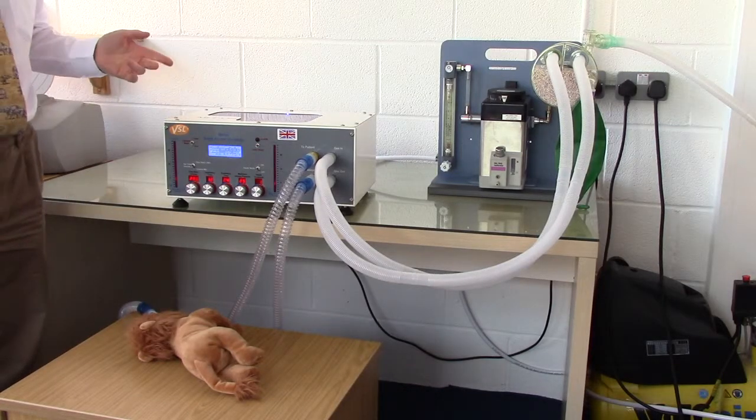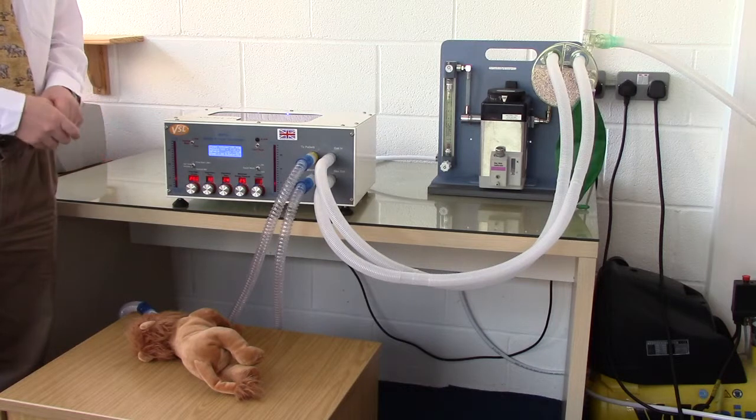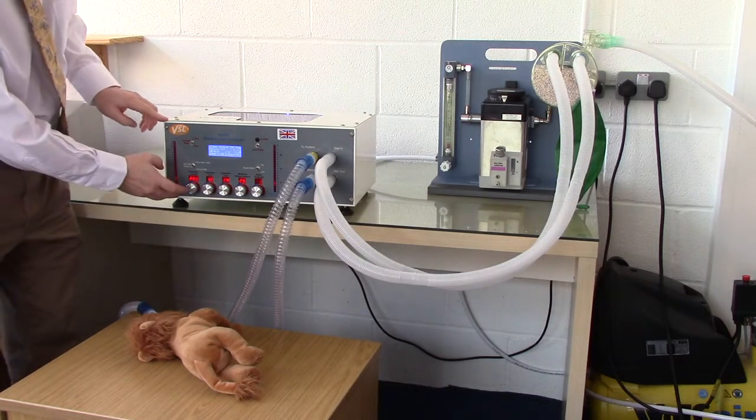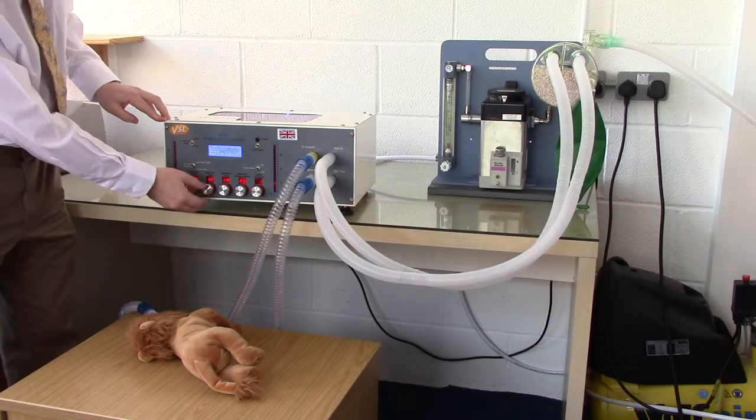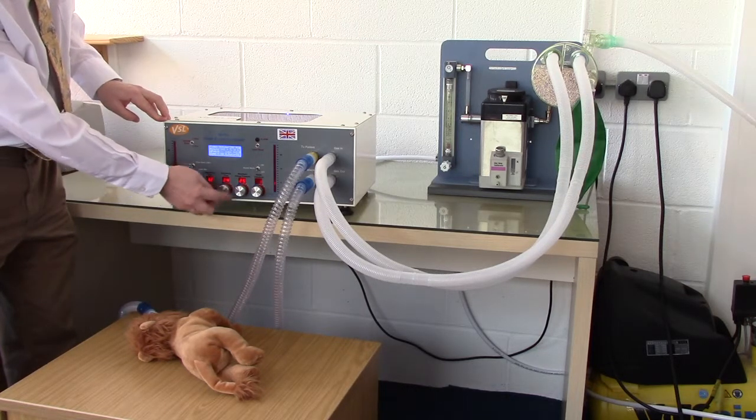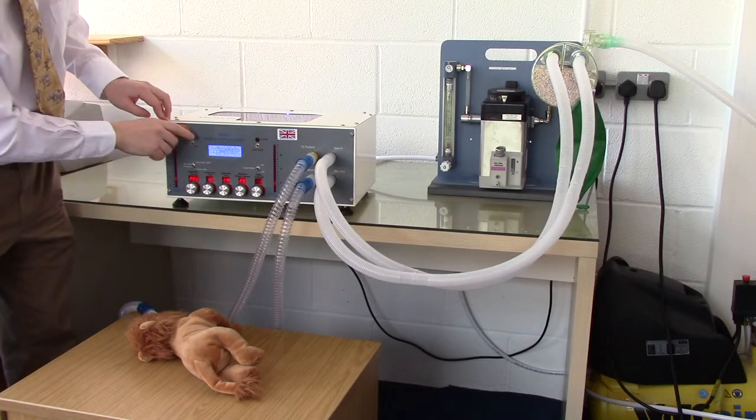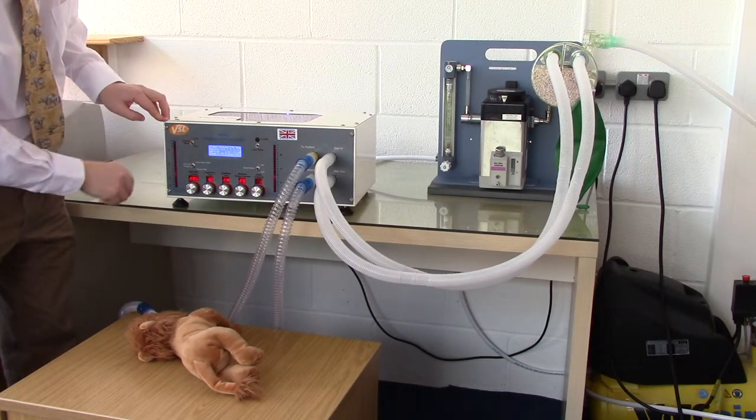I will now demonstrate ventilating an animal with a 200ml lung capacity. Set the tidal volume to 200, the inspiratory time to 1.2, expiratory time to 2.4, and the maximum working pressure limit to 25. Set the system to run.